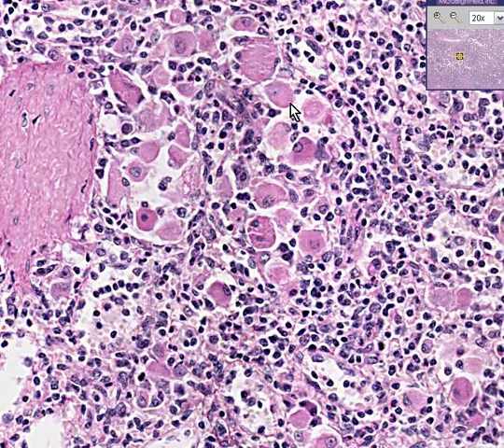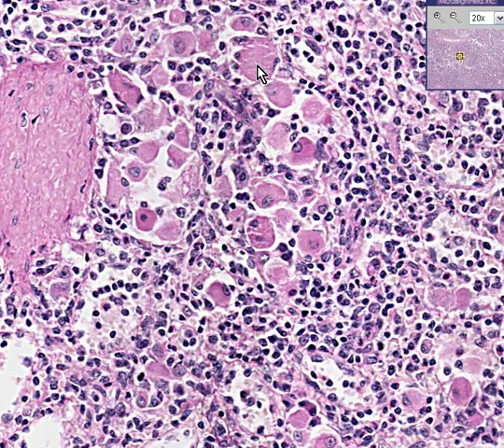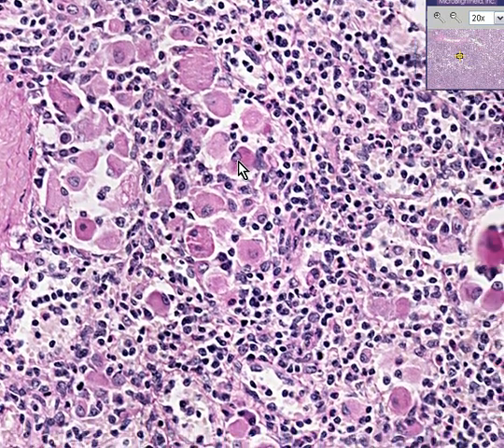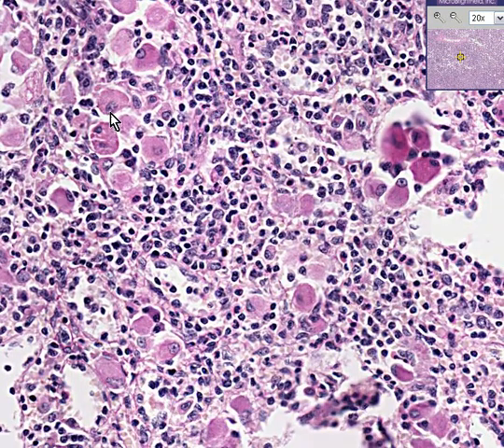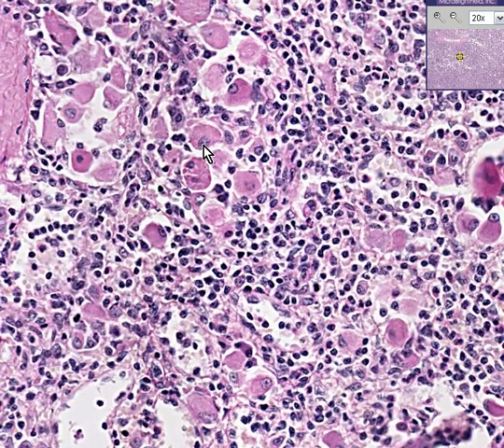So whenever you see these foamy, fuzzy pink cells all over the place where they shouldn't be, think that they might be loaded with glucocerebrosides because of the deficiency of the enzyme glucocerebrosidase. And you can call this Gaucher's disease, and thank you very much.